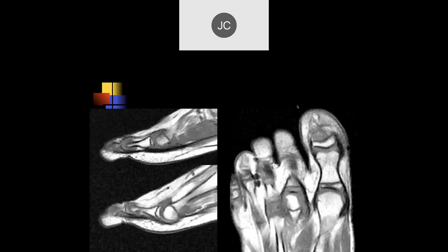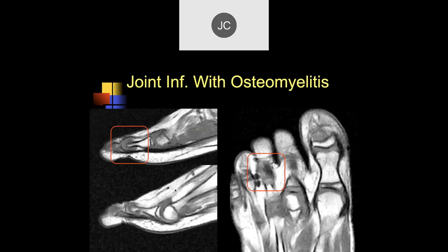Looking at what I think is the second digit, the interphalangeal joint looks like there's a lot of swelling around it — I'd be concerned for an infection. Actually, this is the third digit, and this was osteomyelitis with an infection of the proximal interphalangeal joint.